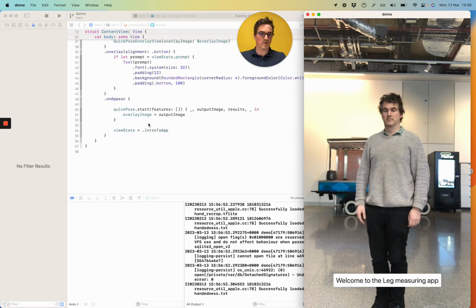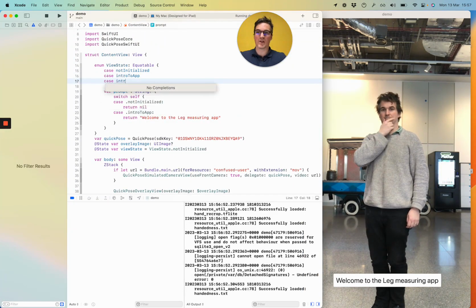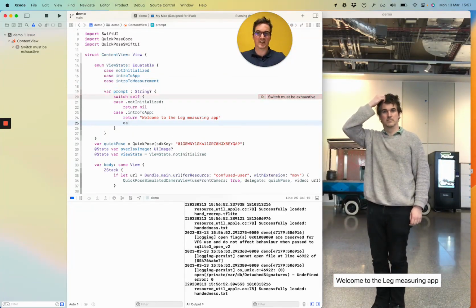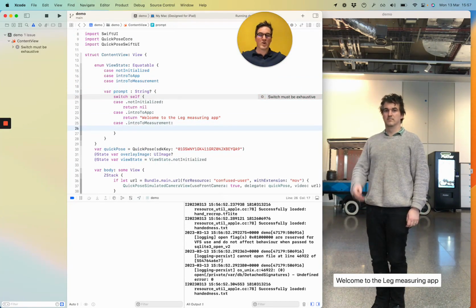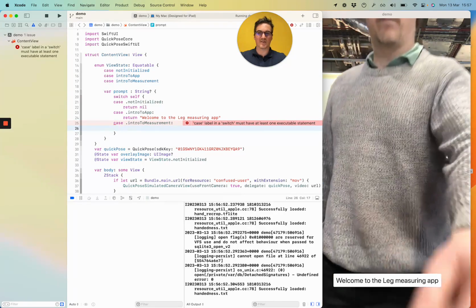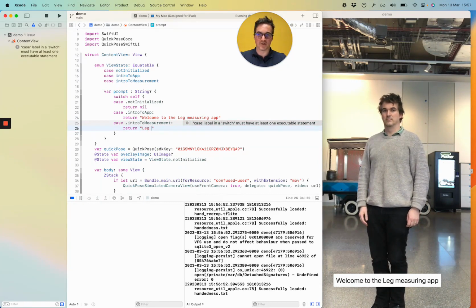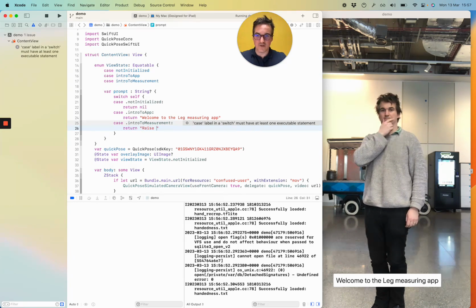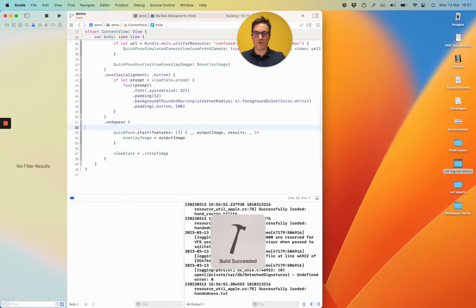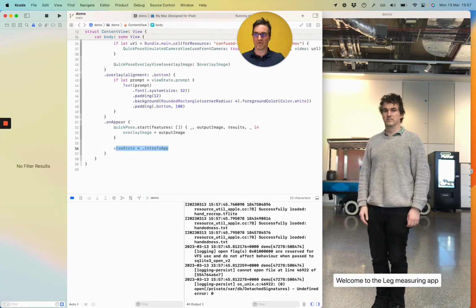Cool. Okay, welcome to the leg measuring app. I'm going to create a new step now called intro to measurement. So the long term is I actually want to show you two measurements in this app because it will be a ready to go app. So the first measurement is a kind of leg lateral flexion, but for now we're just going to call it leg measurement. So raise your leg. Okay, so if I run that, what will happen though is it will go to the intro to app state and it won't go on to the raise your leg state. That's because we've got no real transition from the first state to the second state.